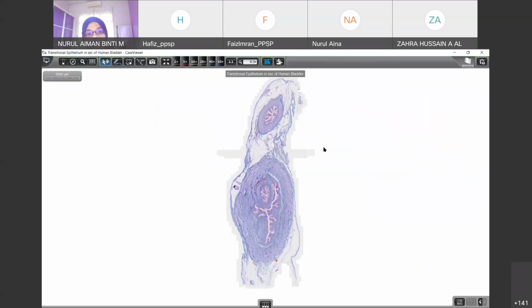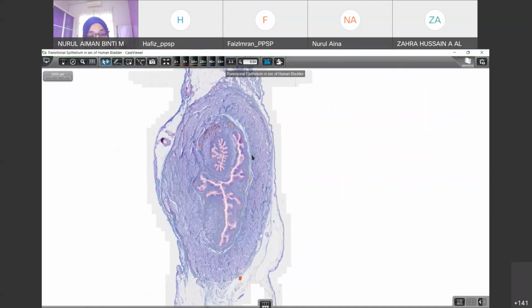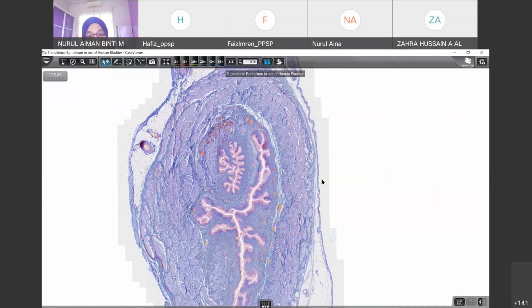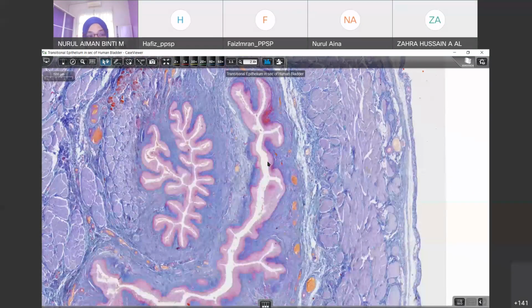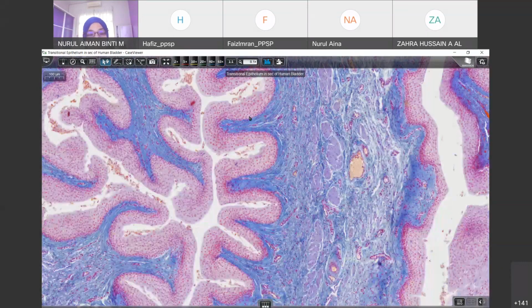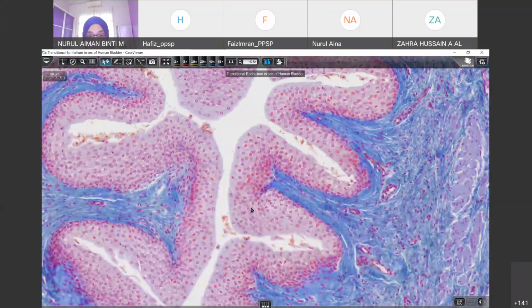Okay, this is the slide of the urethra or human bladder. Yeah, human bladder. Okay, the outer part is different. This might be covered by the mesothelium. To look directly at the transitional epithelium, you have to look at the internal part of the urinary bladder here. Because urine is quite toxic, you need an epithelium that can withstand the toxicity of the urine. So this is the transitional epithelium, which is actually a stratified epithelium.